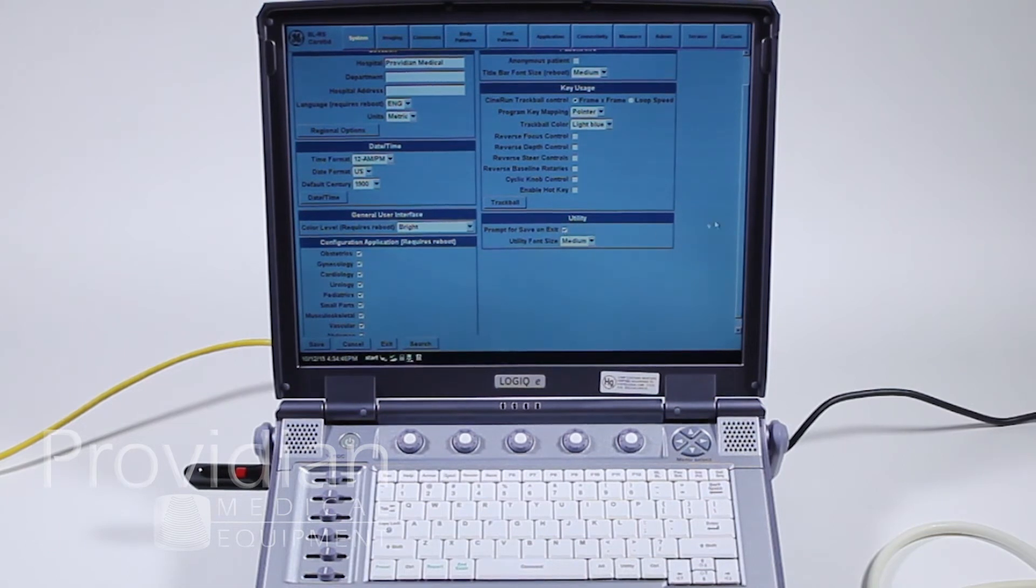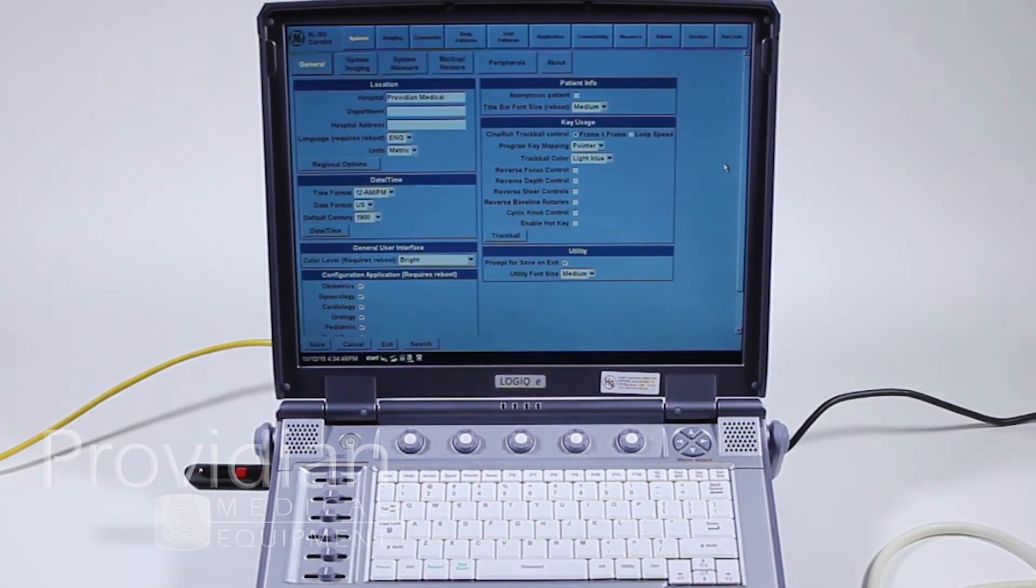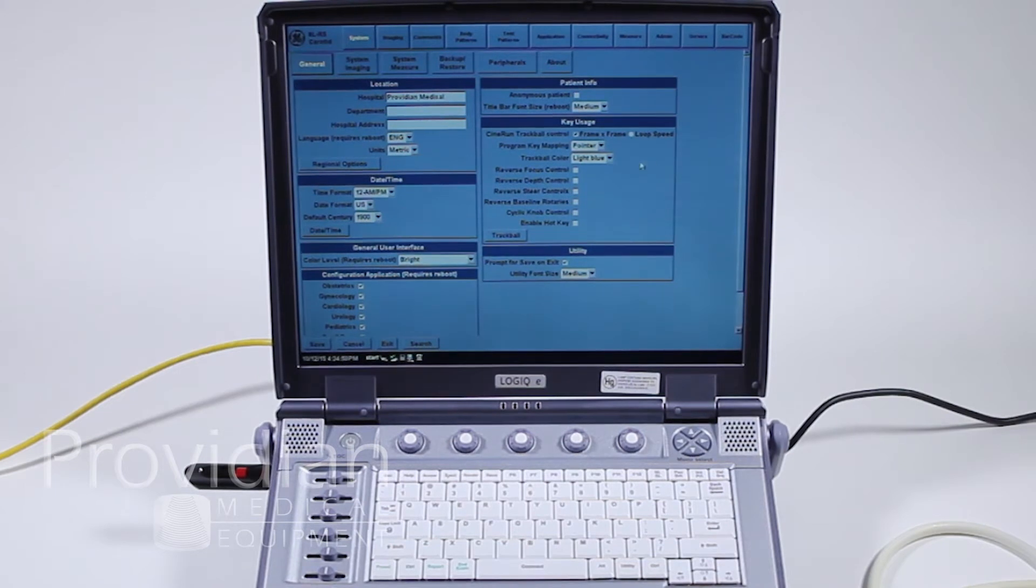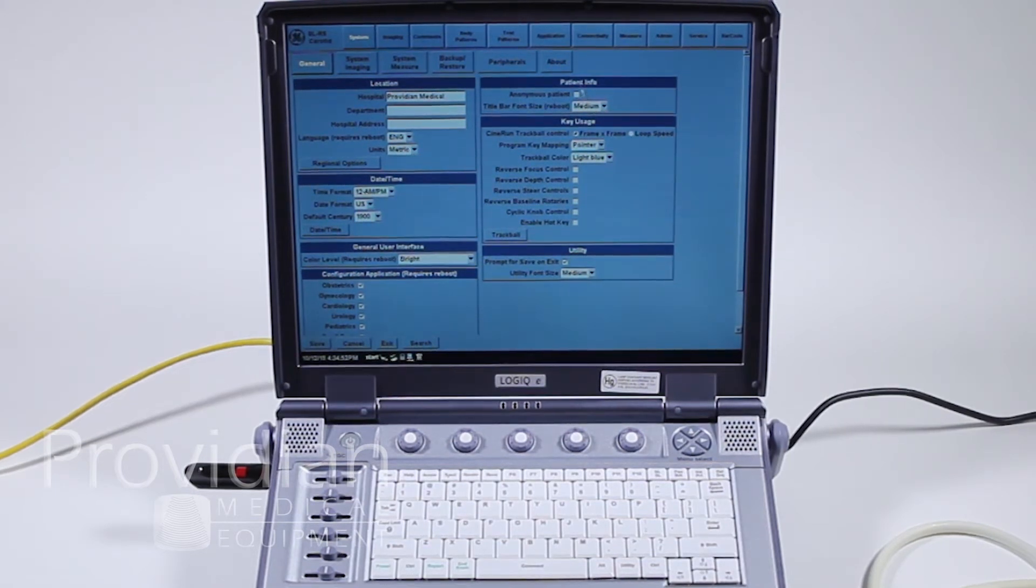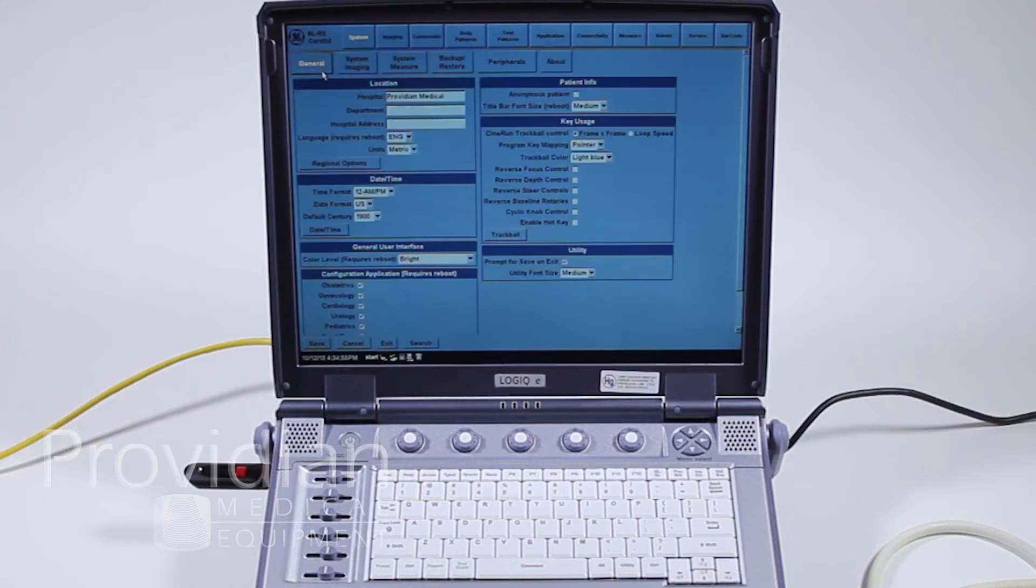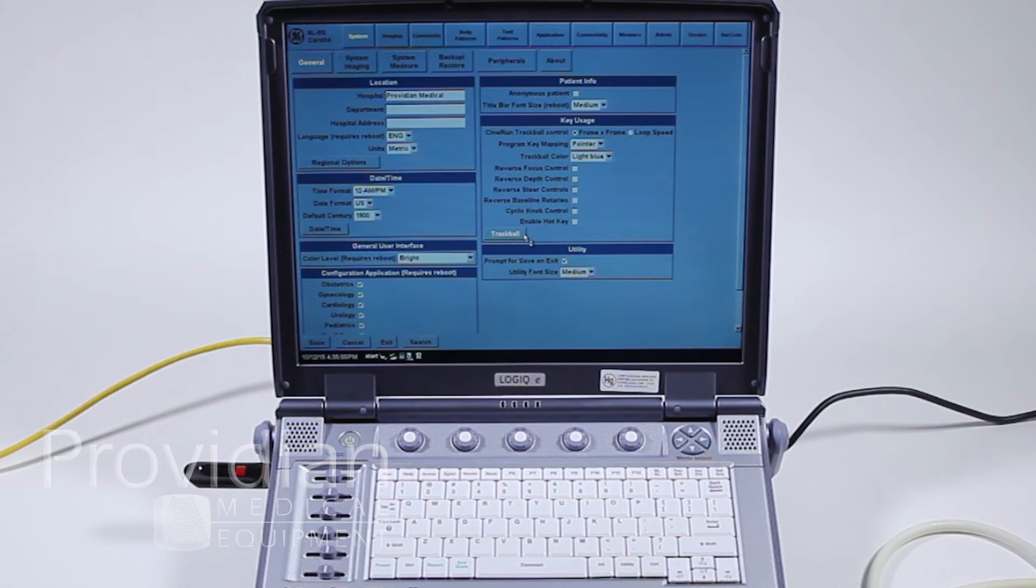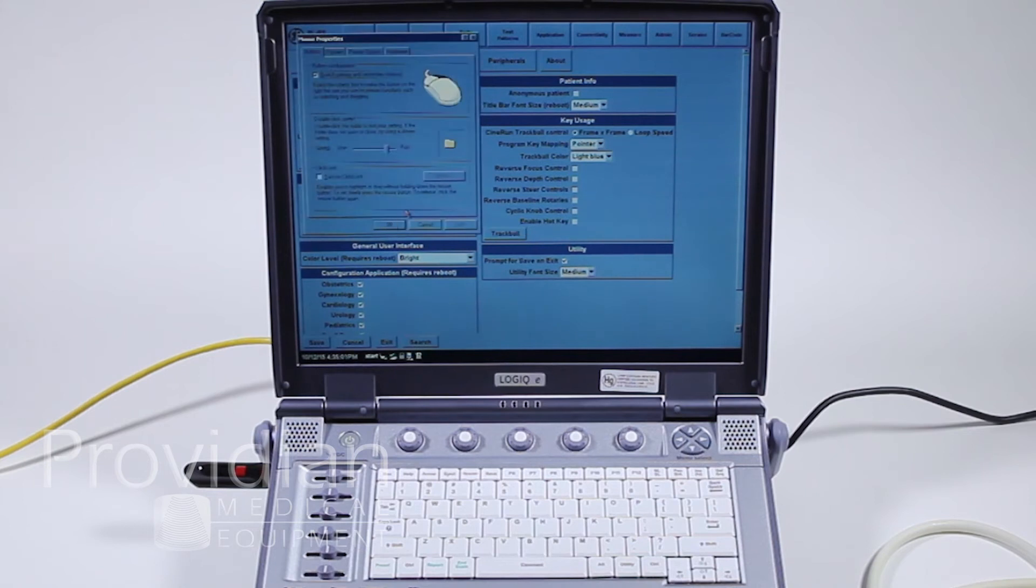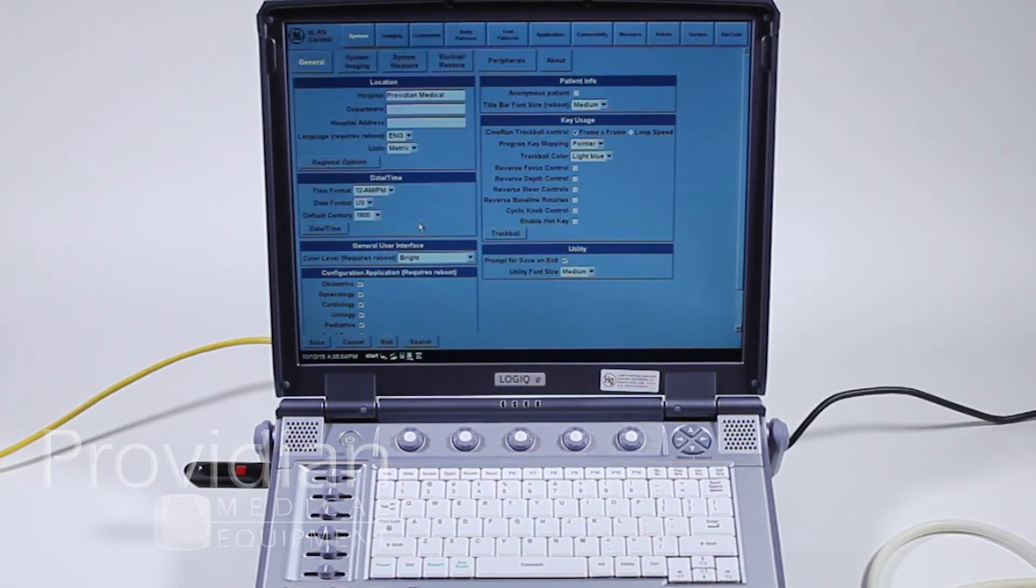Prompt for Save on Exit, if you accidentally didn't save the images correctly, it will ask you. Anonymous Patient will remove the patient information from the top of the screen when you're in the imaging screen. A lot of these are just how you would want to review it, and you can adjust your trackball controls right here and the speed and the sensitivity of the trackball.